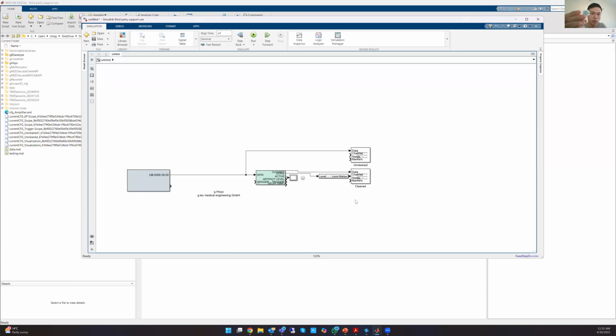This little mastoid sticker has a little metallic dot on top. You just clip it on the clip itself. Make sure it's tight. Same for the reference. The mastoid stickers stick behind the ear, on the mastoid bone, for stabilizing the signal.